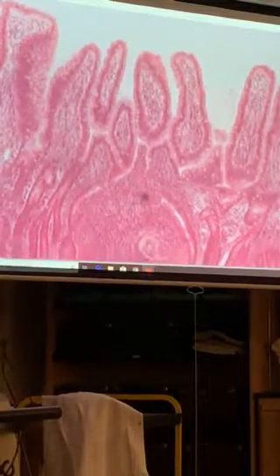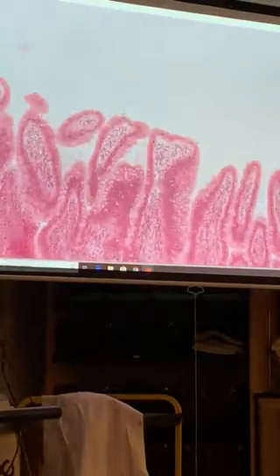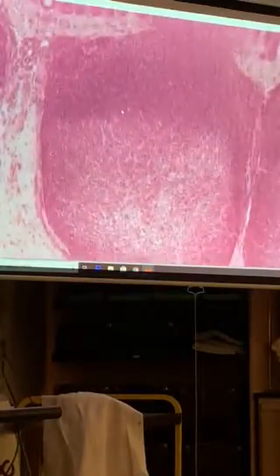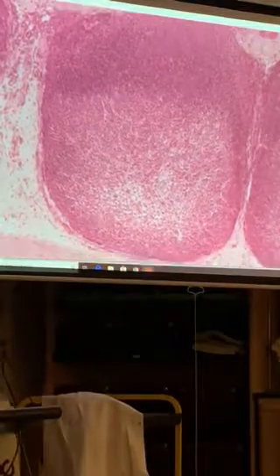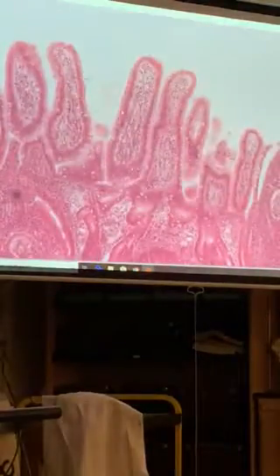Okay, so then as I scroll down, I'm not going to ask you to identify it without being able to see the whole slide. You see these giant purplish structures that fill up the submucosa. Those are called Peyer's patches, lymphatic tissue embedded in the wall. They are huge and hard to miss. And then you go out a little further, and yeah, it just looks like a small intestine. So you know it's the ileum.